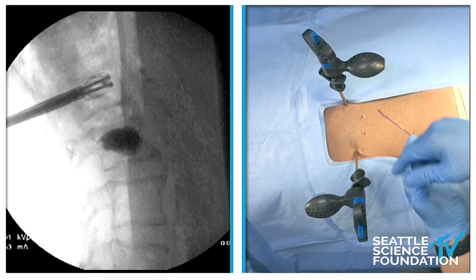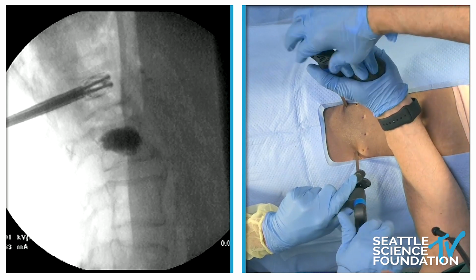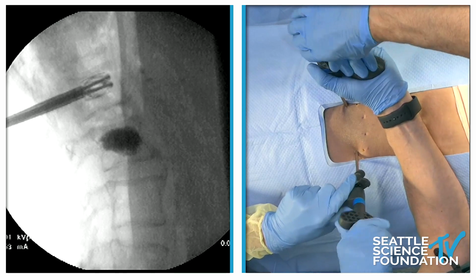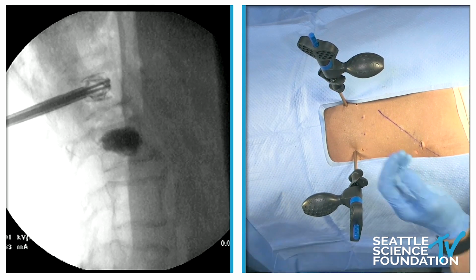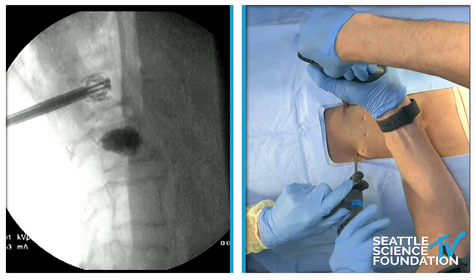Fantastic. So there's 13 turns to completely deploy this thing, and we're going to go ahead and go all the way because it looks awesome. Do we have an example of the device that could be put into the camera's view? Yes, I bet we do.